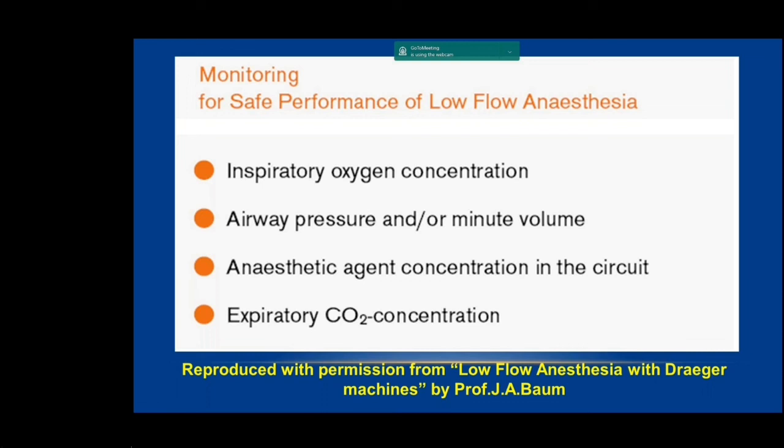You must have a good anesthesia machine, not only capable of doing its own leak test, but it should have a compliance compensatory mechanism.